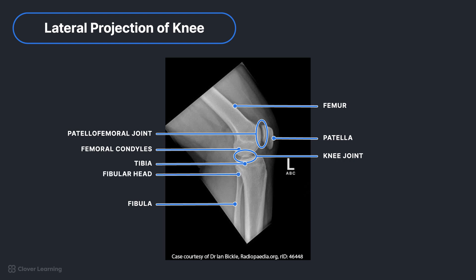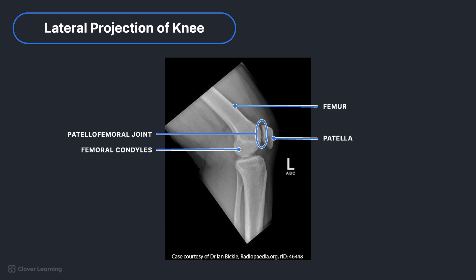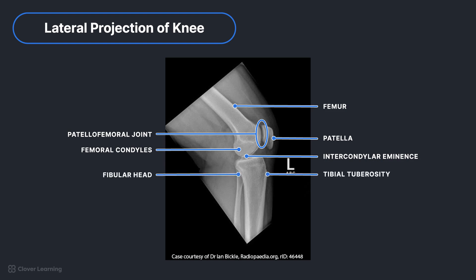As a reminder, the lateral knee is a medial-lateral projection. Looking again from superior to inferior, the following anatomy is demonstrated: distal femur, superimposed medial and lateral femoral condyles, open patellofemoral joint, intercondylar eminence, fibular head slightly superimposed by the tibia, tibial tuberosity, proximal tibia, and proximal fibula.